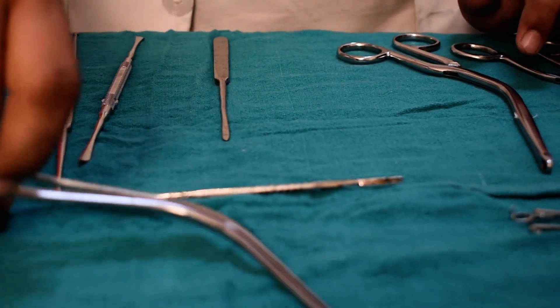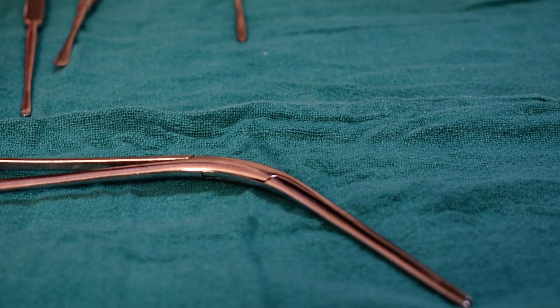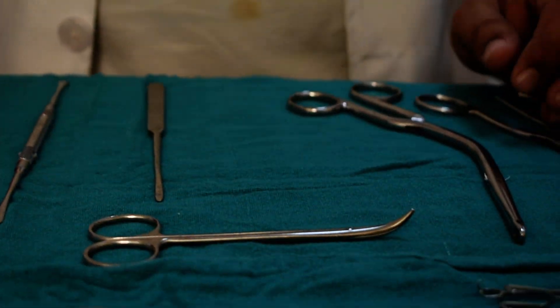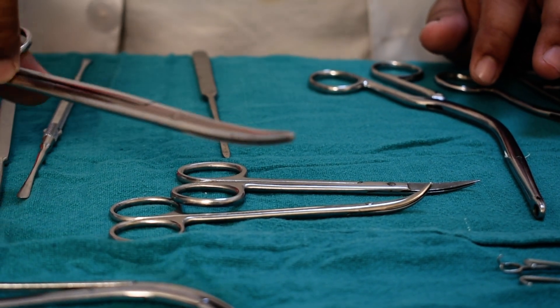This is the packing forcep. This is the thumb forcep used in suturing the flaps. These are scissors used in nasal surgeries — this is a scissor, and this is also a scissor.